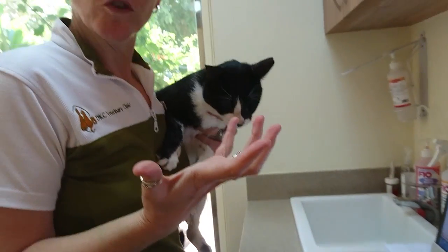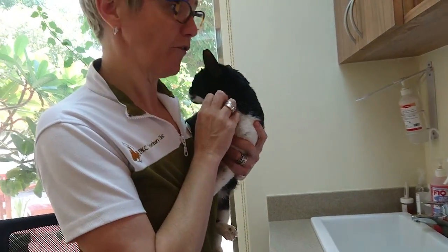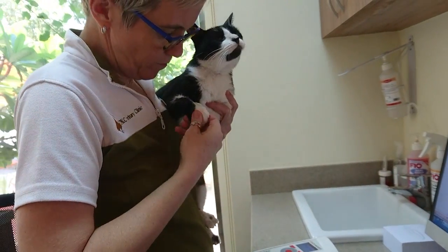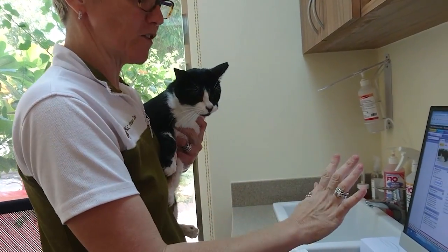So what we did, we got some cool software — we like to get crazy technological stuff — and this is really nice. Basically this reader links up with the practice management software.